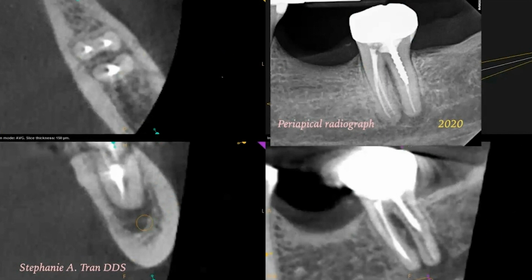So this patient had a little bit of furcation bone loss on the 3D radiograph, and also the periapical radiolucency and that mid-root bone loss in the furcation. There were definitely some concerns in this case of whether or not this tooth had a vertical root fracture. However, there weren't any deep probing depths and no sinus tracts, no other signs of a vertical root fracture.